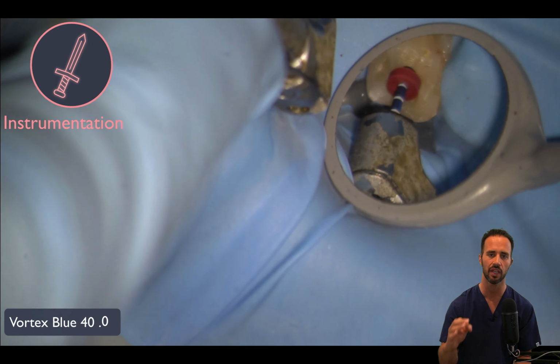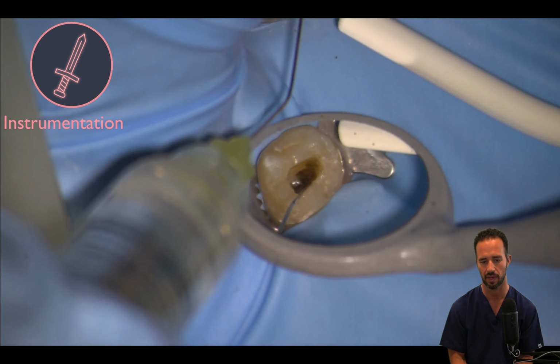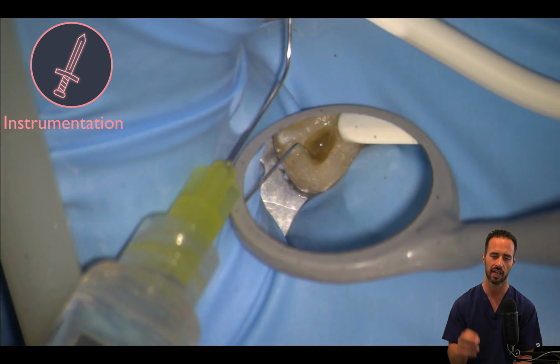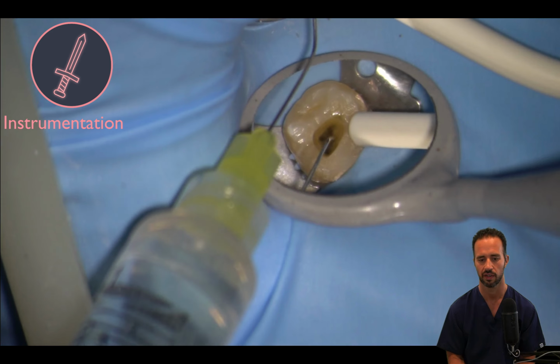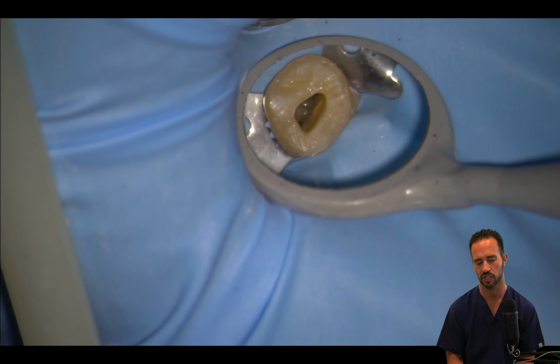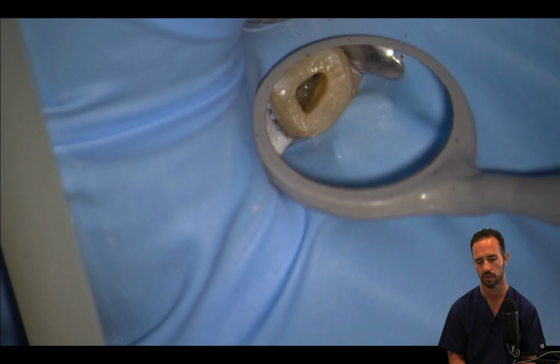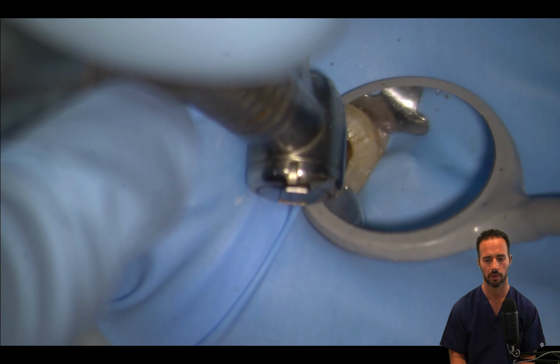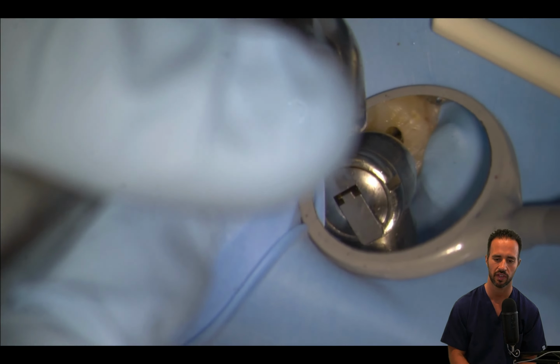So this is a 40/04 Vortex Blue. You need to have a snug fit in the apex, and that went down, and I felt a little resistance there. So the size 40/04 is as high as we're going to go in the palatal. All right, so we have sodium hypochlorite, and now we're going to start searching for our MB2. Notice that we've got sodium hypochlorite really bathing the other canals while we search for the MB2.